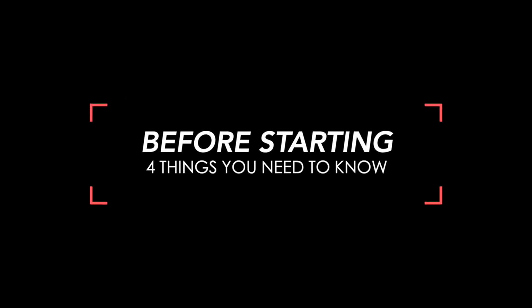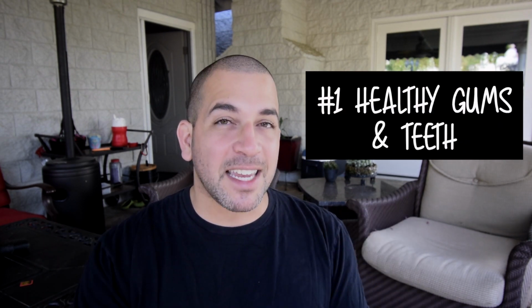Okay, so now that you have a little bit of a background, what are the most important factors you need to consider before starting aligner therapy with an orthodontist or at Smile Direct Club? Well, the most important thing to do is to make sure your gums and teeth are healthy.